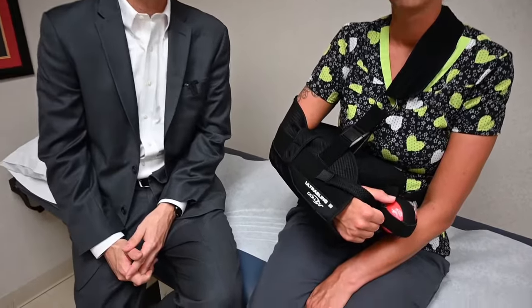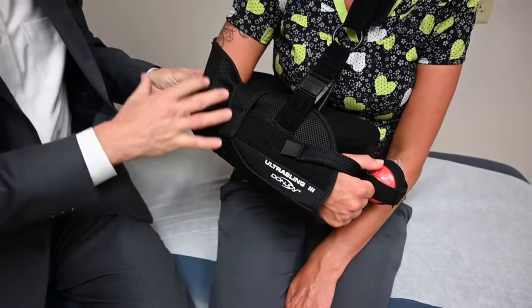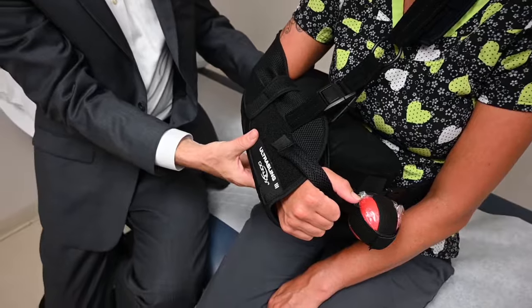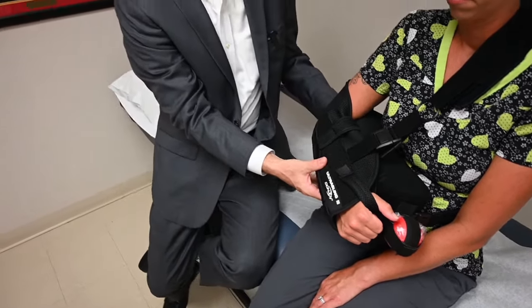Most of you know Carrie if you have already discussed your shoulder surgery. This is the standard post-operative shoulder abduction pillow that you will wear after your shoulder surgery. It has a main sling portion as well as a pillow that helps to hold the arm out away from the body. There are a number of things you want to keep in mind when adjusting your post-operative shoulder immobilizer.